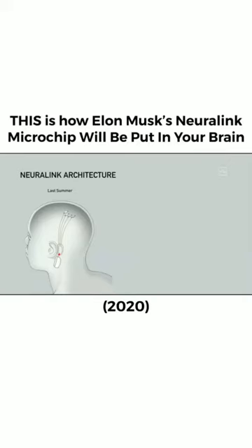So going into the Neuralink architecture, what we've done over the past year is dramatically simplify the device. About a year ago, we had a device which had multiple parts, including a piece that had to sit behind your ear, and it was complex, and you wouldn't still look totally normal. You'd have a thing behind your ear.